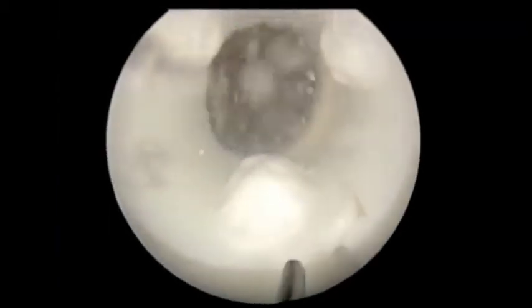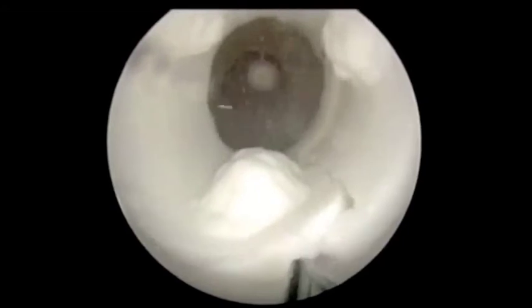In this video, our system operates on a prostate model. The right arm cuts with the laser, while the left arm retracts. Much of this procedure was done without manipulating the endoscope, indicating that the dexterity provided by the robot may make this procedure easier for the surgeons.